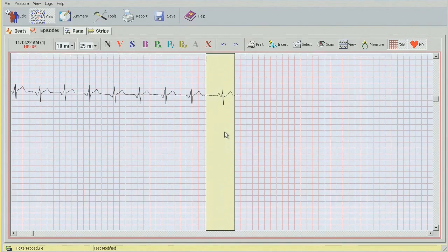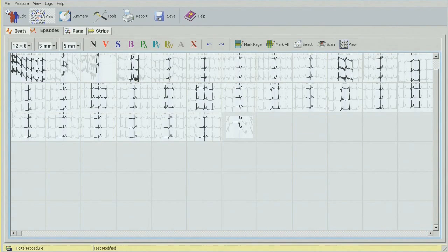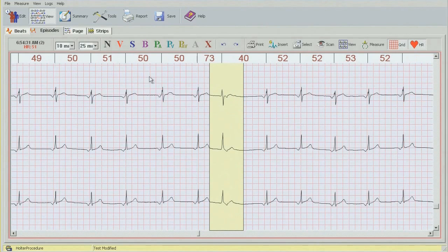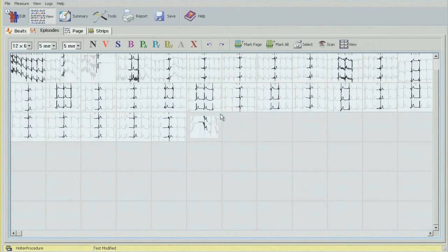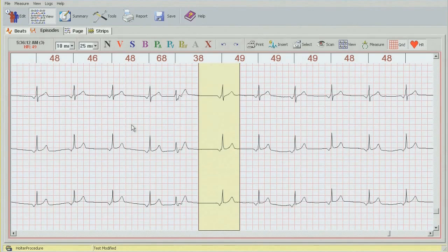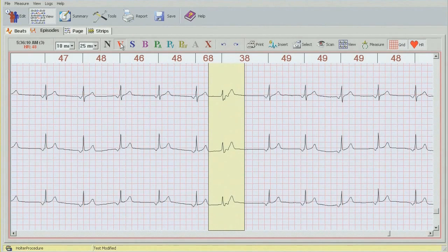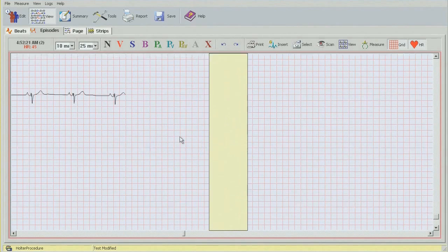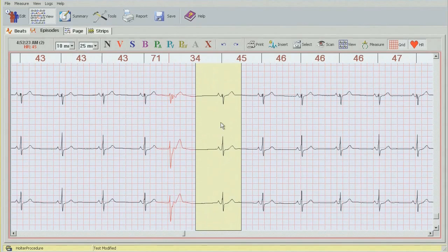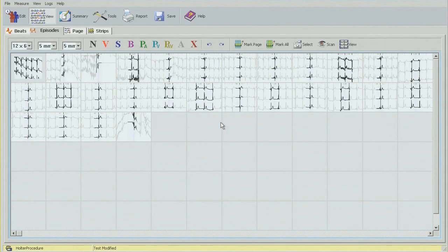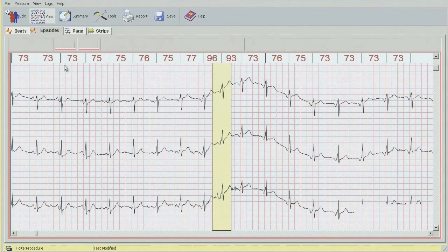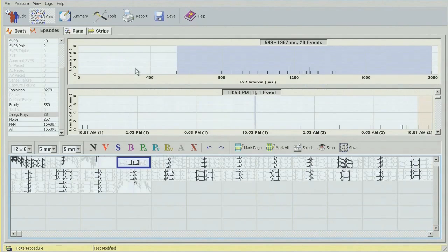Going back to the bin by double-clicking — I don't see anything else. Actually there's a beat here in front of the one showing, so I'll go in because this one is early. Same idea here — these two are a similar story. This one is a ventricular beat, which I'll change to ventricular. Moving on to the next one — there's another ventricular hiding here. Double-click to go back, and everything else seems to be normal.